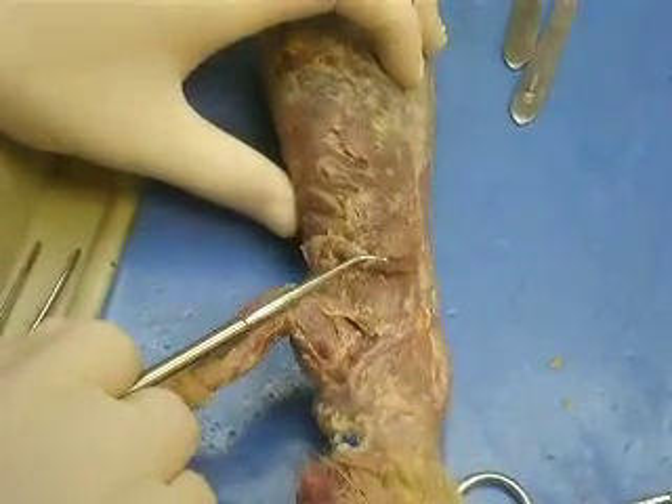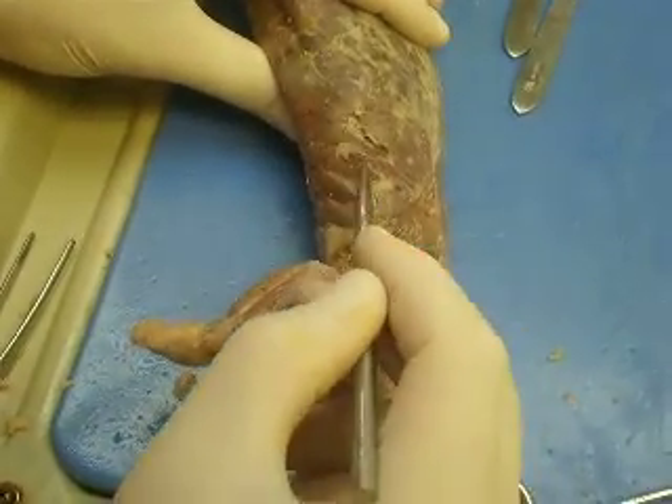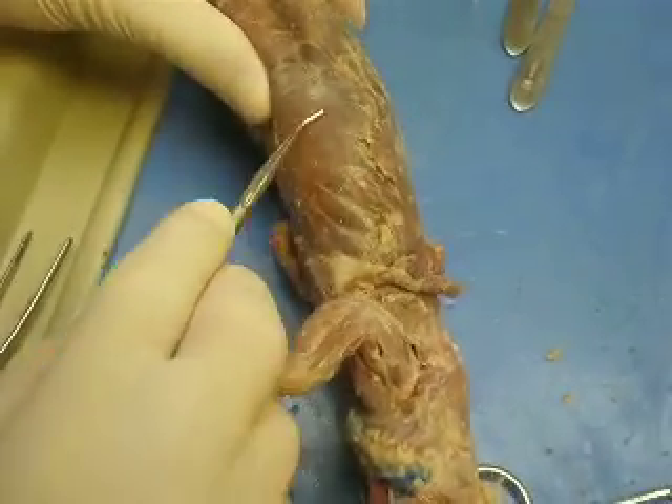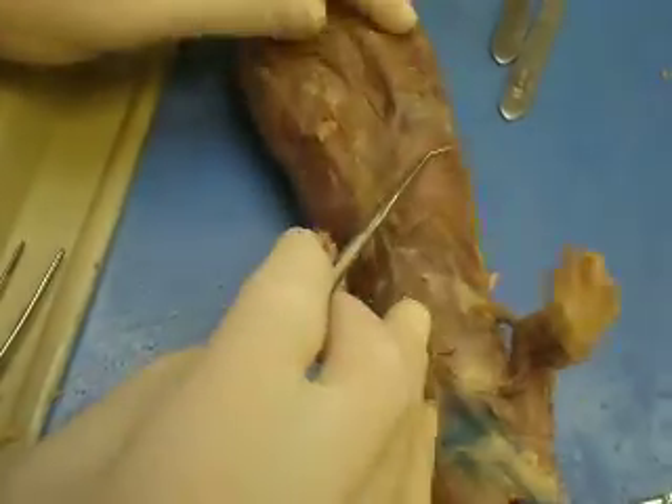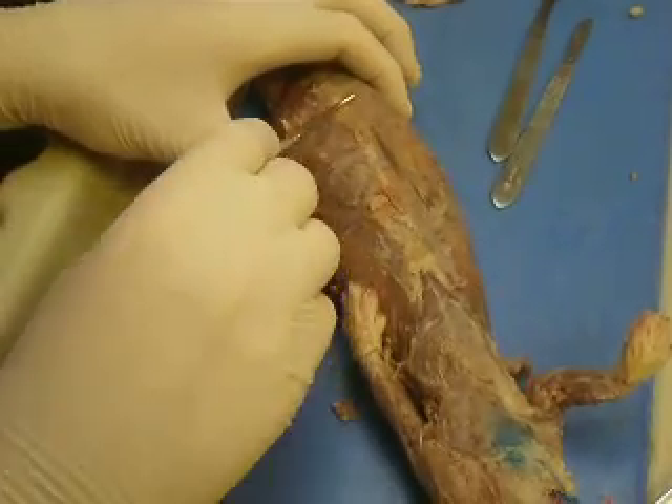Latissimus dorsi is flopping here, freely. Serratus ventralis is underneath it. On the other side of this fat line, you have the external abdominal oblique. And then down the middle here, separated by this color difference, is the rectus abdominis.